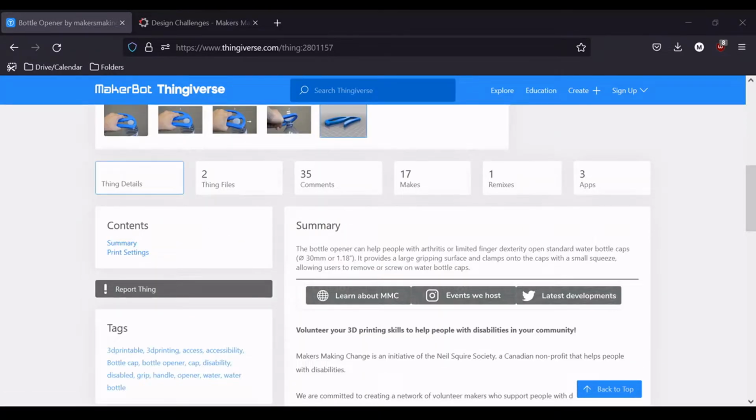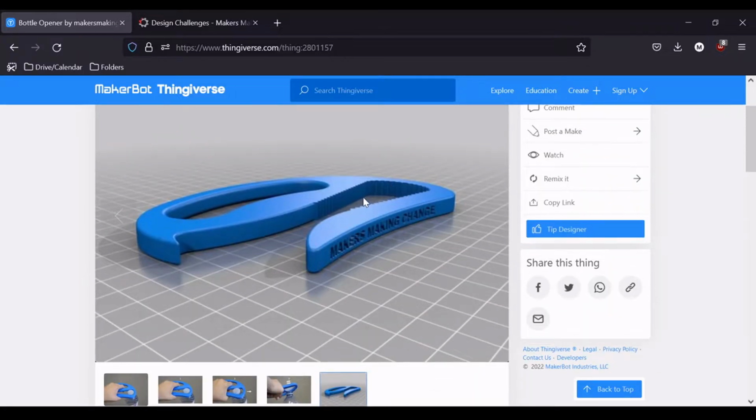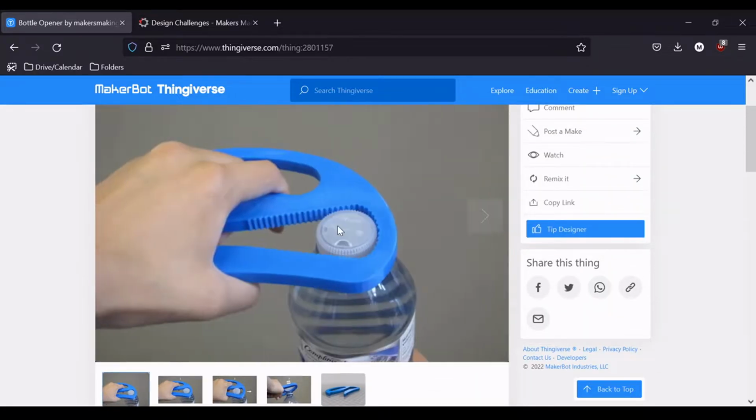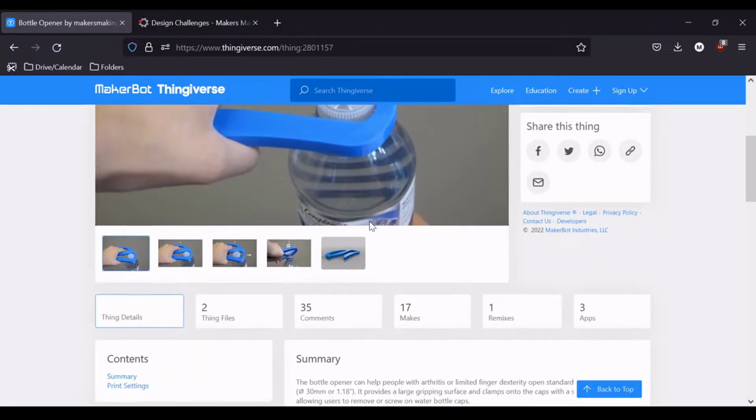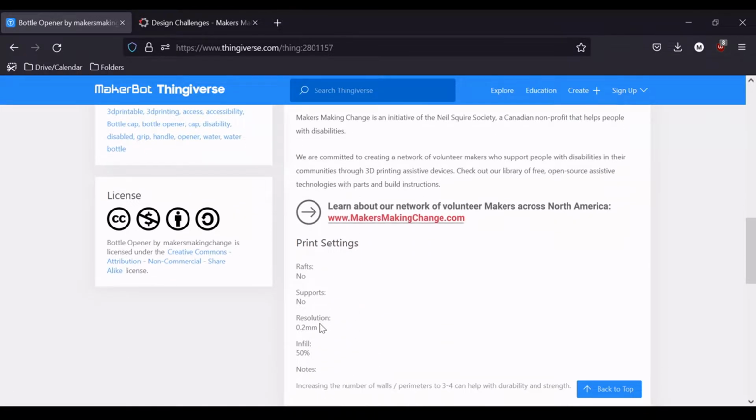So now that we're here looking at the design itself, we can talk a little bit about it. One of the things that I really like about this design is that it has this longer teeth setup, which I found to be really good for fitting multiple different sizes of bottles, which is something that not all of the designs have. If we scroll down here, we can see some of the settings that are in Thingiverse.